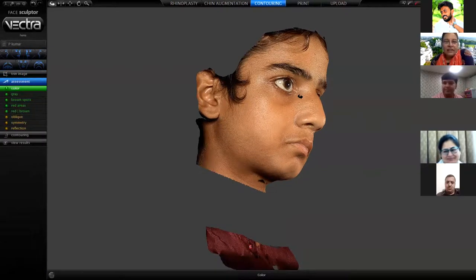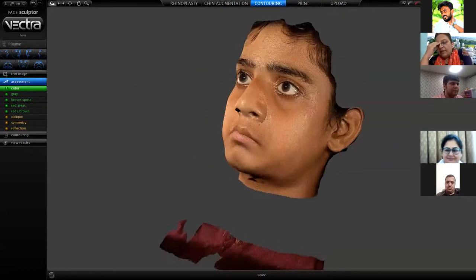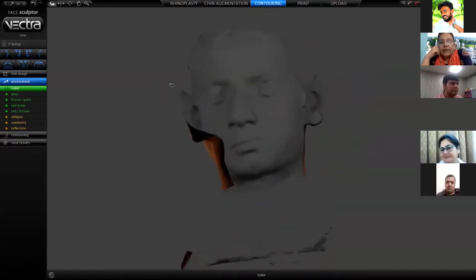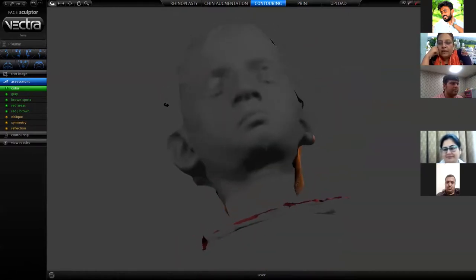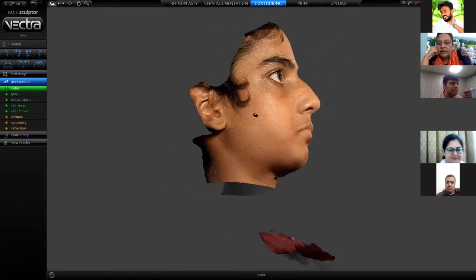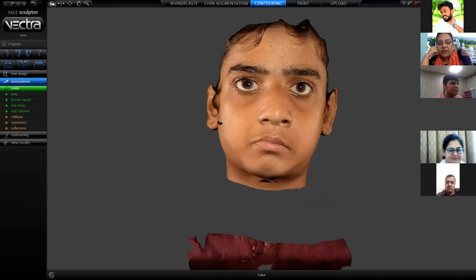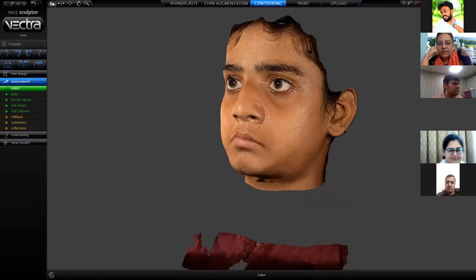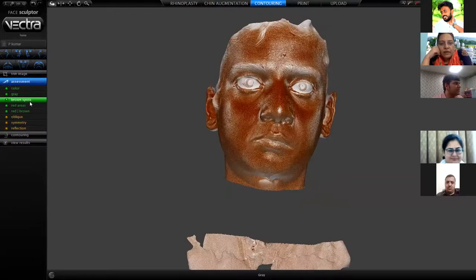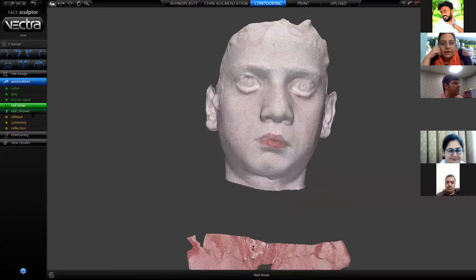There's a question. Is the intraoral scanning combined with extraoral scanning in certain cases? Yes, we can club them. We are planning to do a study to see the accuracy of the extraoral scanning by comparing it with the CT scan soft tissue profile and see what the deviations are. This is what Pradeep is currently focusing on, because all these systems are there, but the accuracy is still not yet defined. So we need to study the accuracy of all these tools. These are the various tools available.